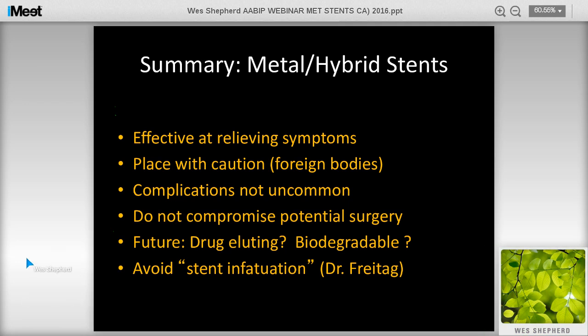And we have another question from Dr. Klaus Lesnow asking, how do you remove metallic stents if that's required? So, again, in the context of malignancy, all of our metallic stents would be removed with rigid bronchoscopy. And typically, metallic stents placed for malignancy are easier to remove because they've usually been in for shorter periods of time than metallic stents that were placed for benign disease.